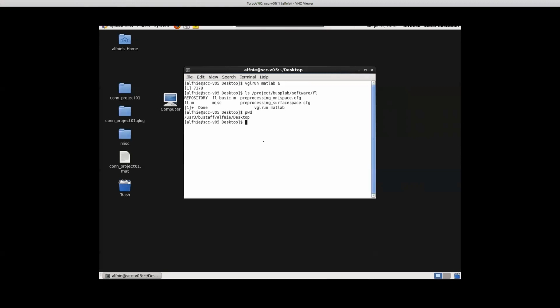So if your question is why don't we get two files, one that contains the actual surface-level subject representation data for that subject and another one for the FS average space, I don't have a good answer. It's probably because it's not particularly useful to have that version of the data, because it cannot be co-registered across the individual subjects, so it cannot be used for any further analysis. And it also doesn't help with the plots, because most plots assume that your data is already in FS average and use that for displaying, and even the plots that actually use the surface-level information can do the interpolation back from the label.